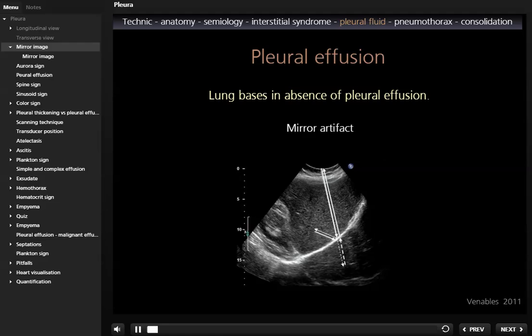At the lung interface, the air-soft tissue interface acts as an acoustic mirror, producing a mirror image of the liver. High-intensity reflected sound is reflected several times within the liver or spleen, prolonging the time of return of echoes to the transducer. Prolonged time of flight is interpreted as being deeper in tissue. Thus, images of the liver or spleen are displayed above as well as below the diaphragm.